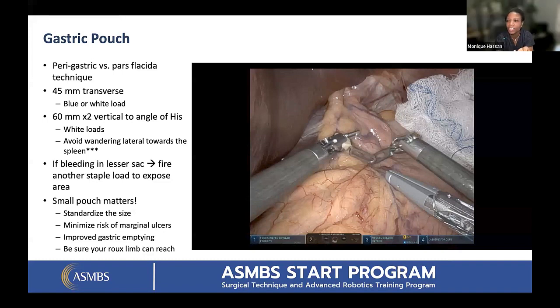Yeah. And also they say that if you were going to do a reversal. Right, I was just going to mention that. A reversal of a gastric bypass, you may have some issues with pyloric emptying and things like that. But I have not seen that. I even reversed one of my own and she did just fine. So I don't know. You're right, we don't have enough studies or good information on that.